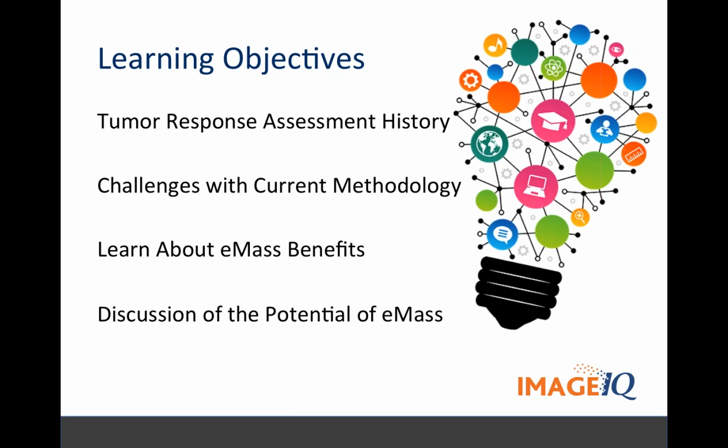But look, just as a review, we did get through that wonderful history of tumor response assessment. We talked about some of the challenges. You saw eMass. What I think is really cool about it is, you do these measurements, you run through that workflow, and it gives you all of the historical assessment data as well as all the new ones with new biomarkers and new capabilities, and that is actually pretty cool.